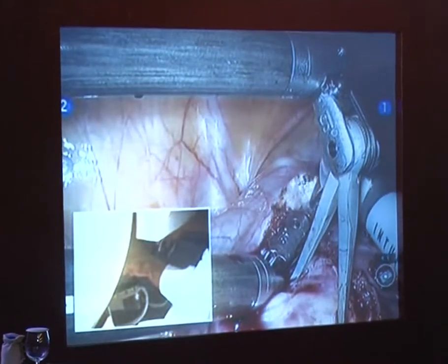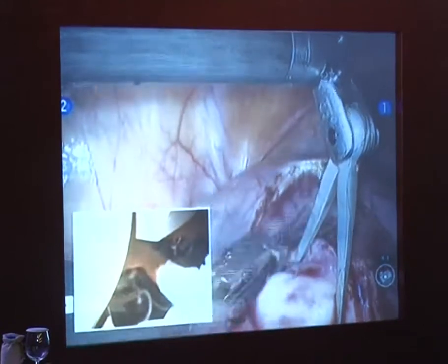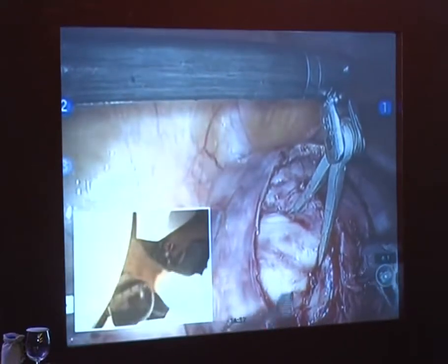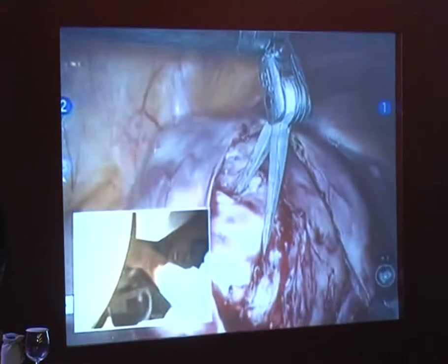Let's see if I can, again, delineate the plane correctly here. Again, I don't want to take myometrium that's not supposed to be removed. I sort of misspoke there.